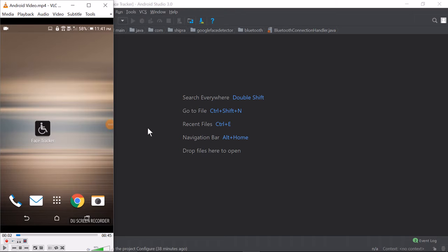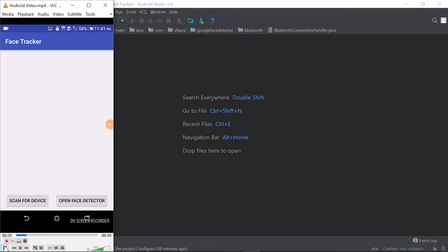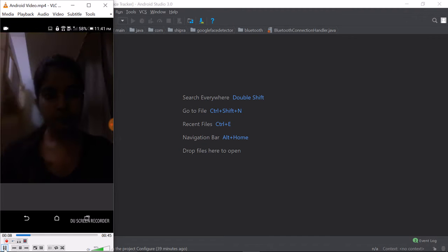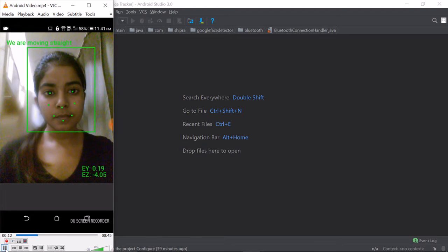What you see on the left of your screen is an actual screen recording of an Android phone. This is how our application looks like. This is where you can scan the Bluetooth that are available and connect it with the device. Open the face detector to see how the application actually runs. So this is what you see when you initialize the app.